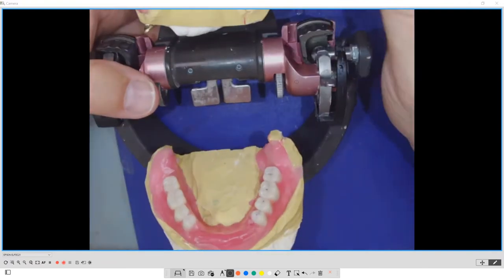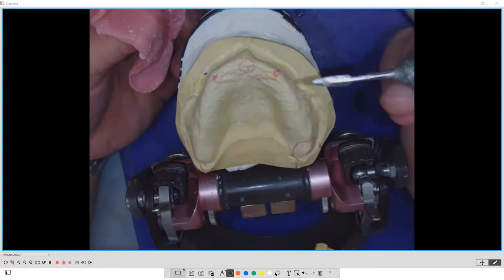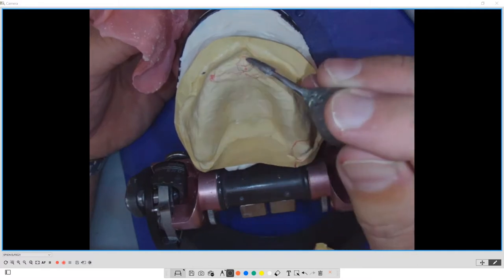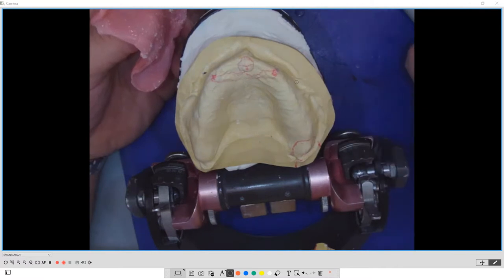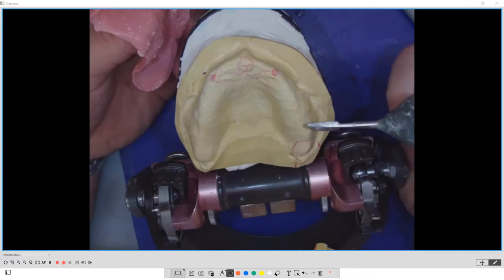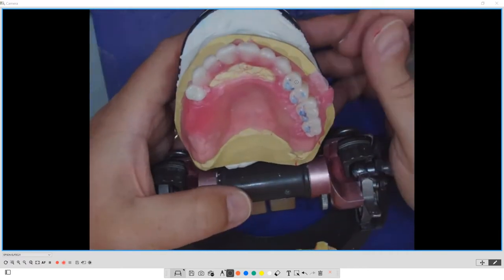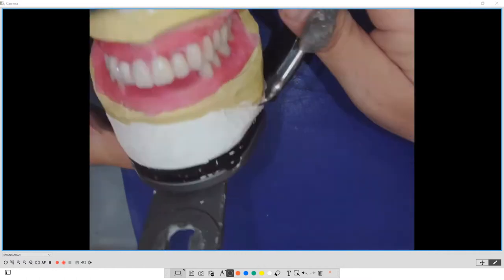Remember, the software is basing the setup on model analysis. So when you go through model analysis, it's actually critical that you put those dots accurately. Wherever you mark those dots and their reference dots, depending on the software that you use, you have to make sure that you're accurate where you put it. Don't rush that job. Don't rush that step, because the software is basing setting the teeth on that, what I've just showed you, and that's accurate, and it needs to be accurate. So please don't rush that step. It's really important digitally, because that's what the software is using to set the teeth in for you. Okay, so it's using what I showed you here conventionally, and how to manipulate it conventionally. That's what the software is doing digitally.